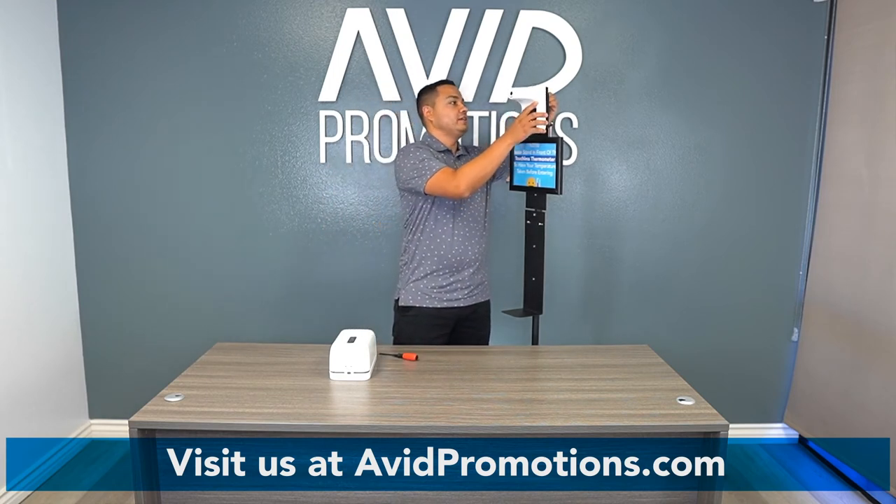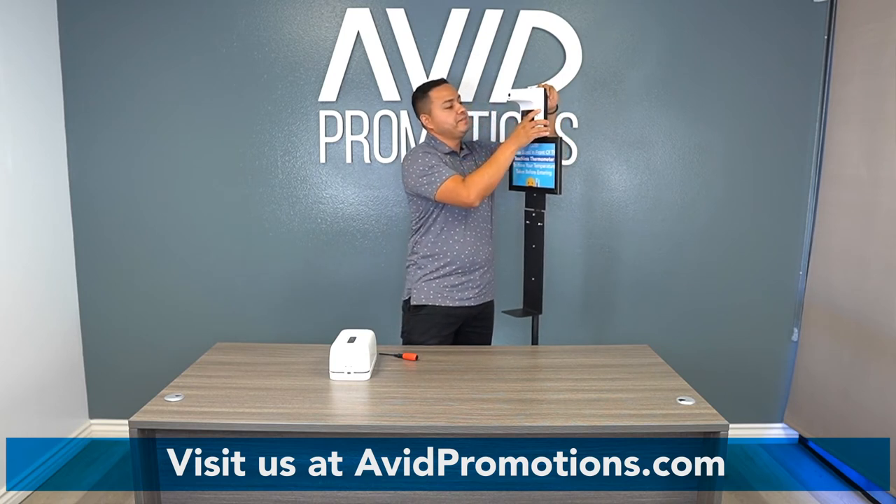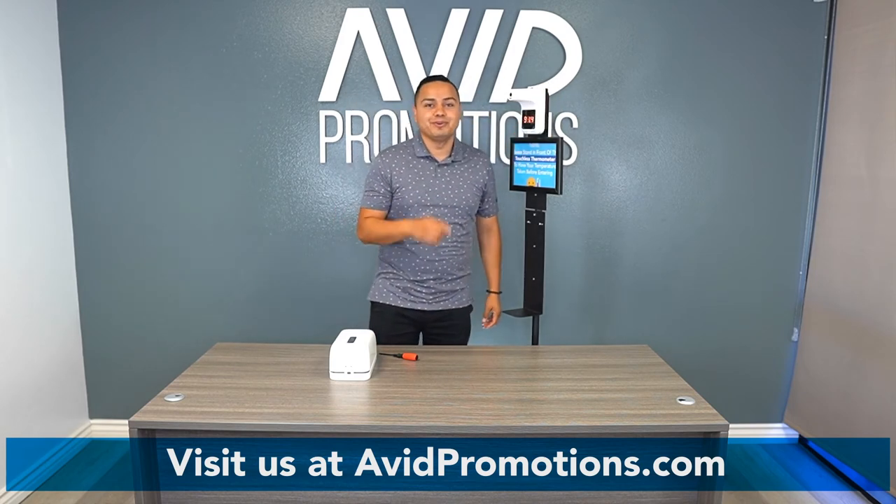You're going to go right in, just slip it right down onto the stand, and tighten it up. Now we're ready to go and in business.